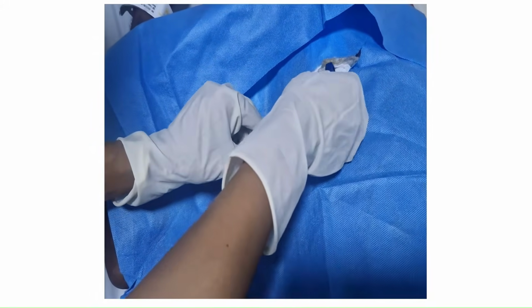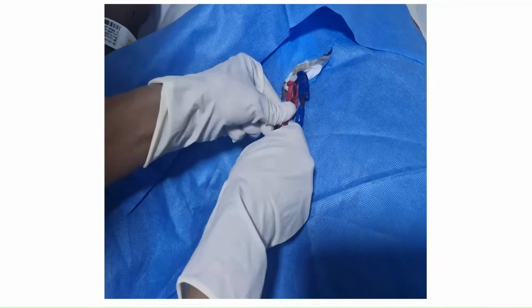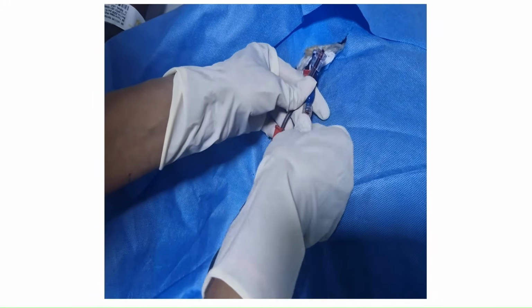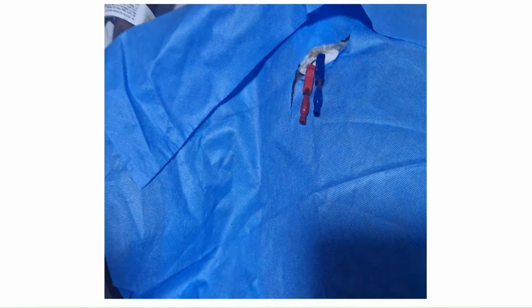So clamp the blue lines and clamp both the red lines and disconnect the inlet and return lines from the patient HD catheter. After disconnecting, flush the HD catheter with heparin and close the tube and do a sterile dressing.